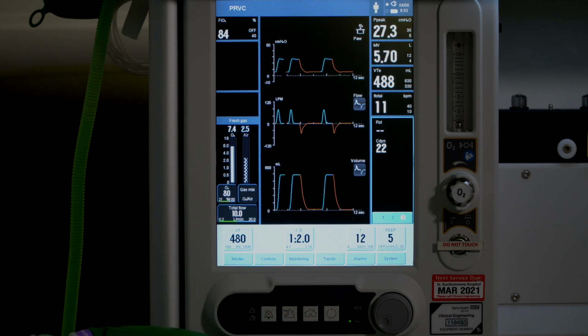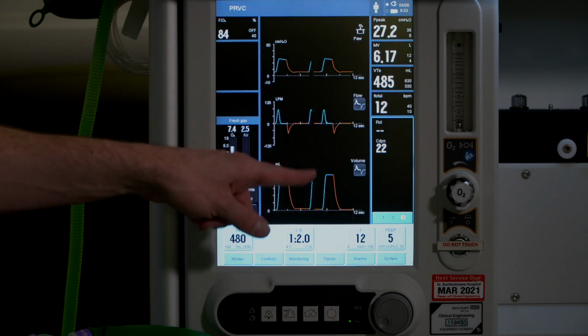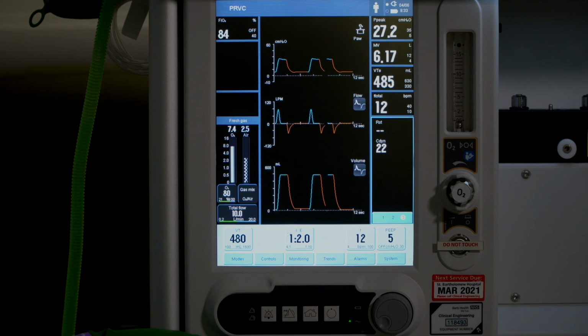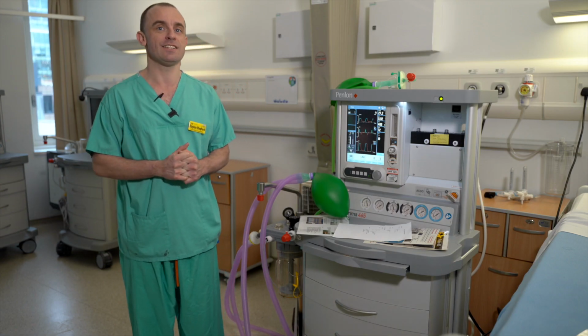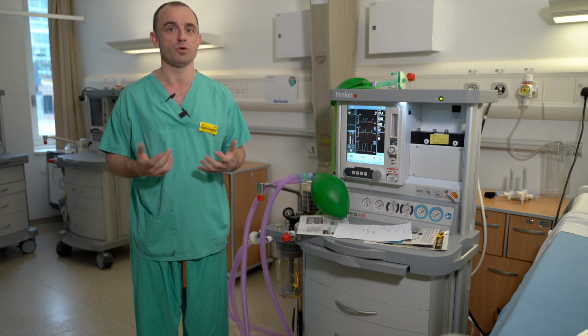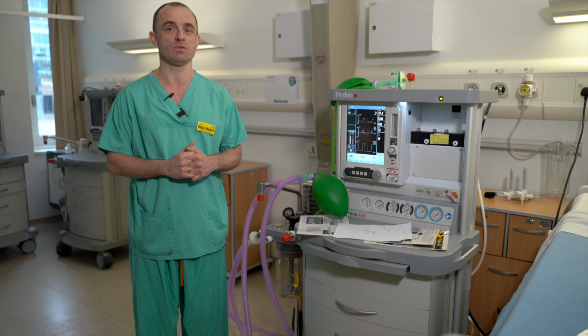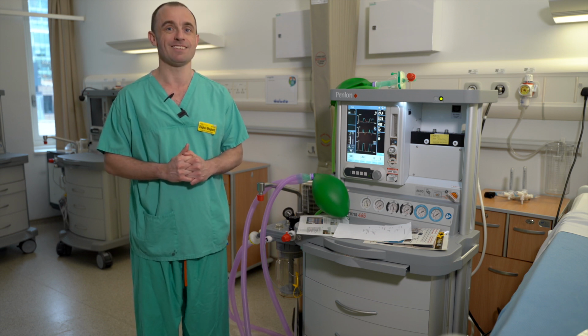So we've also seen that we've got a blue line before every breath. A blue line means that it's a mandatory breath. You'll see later that you may also see yellow lines, which are triggered or pressure support breaths, or pink lines, which are backup breaths, which I'll talk about in a second. But a blue line is a mandatory breath.